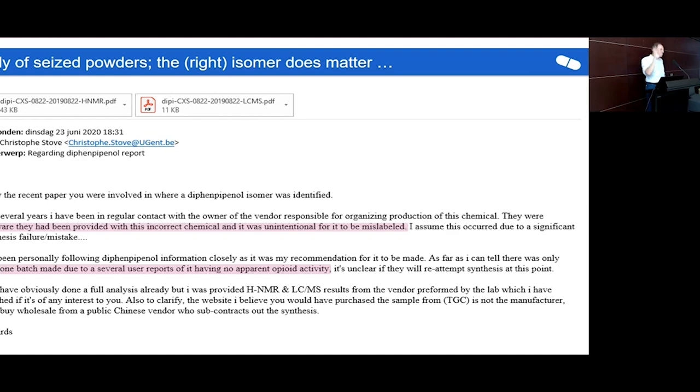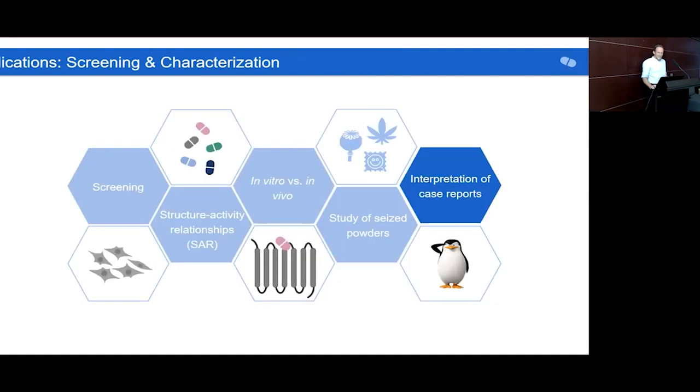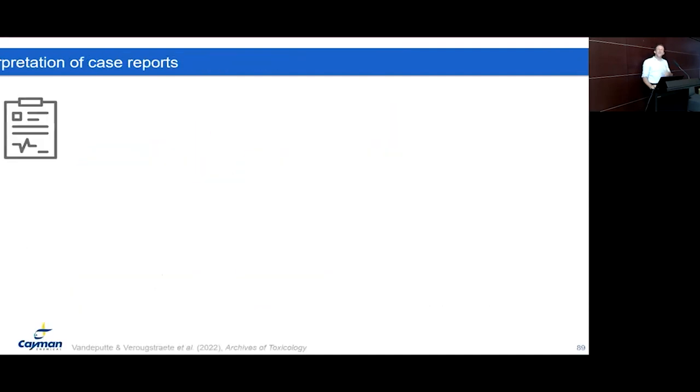The NMR profile was also quite similar, and we also had to team up with medicinal chemists that are really into that. That way, they could figure out it was an isomer, which isomer it was, and that it was the wrong one. So a nice story to get feedback like that. Good. I come to the last part, a case report, and again it ends with some feedback.